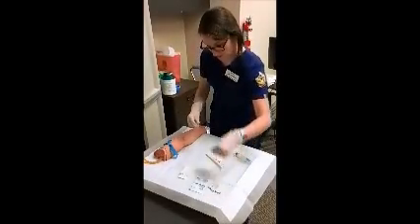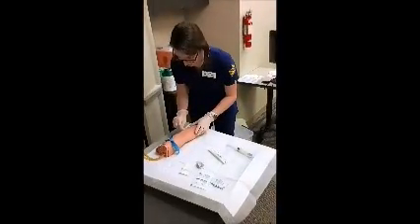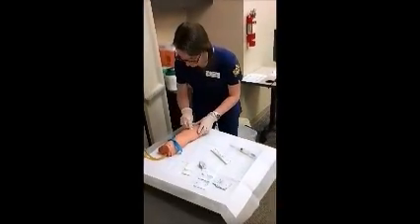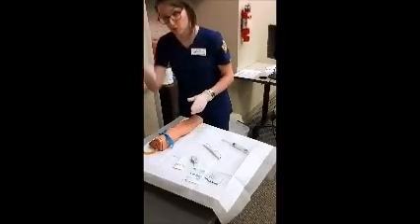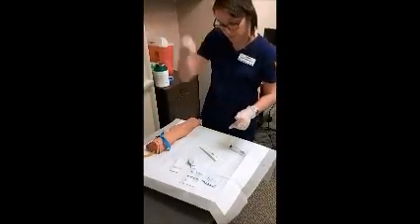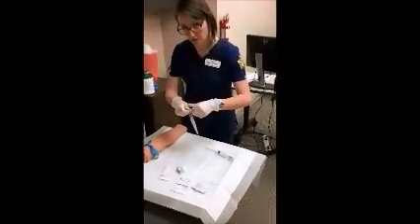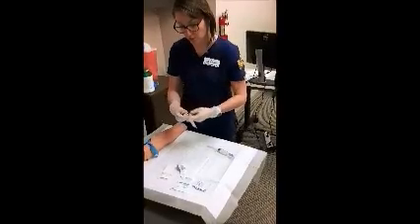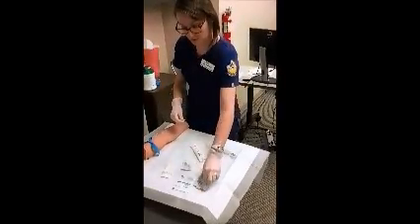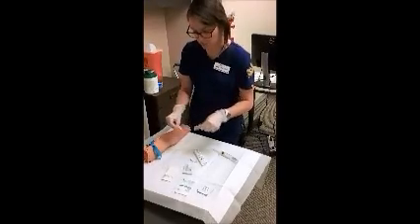So go ahead and alcohol his vein here. We'll start moving in a circle from the in to the out as well. If you're using a chlorhexidine swab, you're going to want to make sure you go in a cross-like pattern. And while that's drying, we'll get our alcohol it twice. We're going to go ahead and use a second alcohol swab.